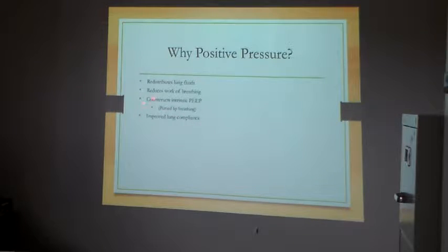It improves lung compliance, okay? Keeps the lungs open. It reverses atelectasis. Remember those dead spots or those areas that are stiffened? It blows them open. Somewhere for that air to go. Fixes collapsed alveoli. Decreases preload and afterload. What that means for the heart is the heart doesn't have to work as hard, and that's for your CHF patient. Okay? It makes a big difference because there's not as much fluid. All right? And then, of course, it fixes or decreases VQ mismatch. Well, that lung that was closed is now open.